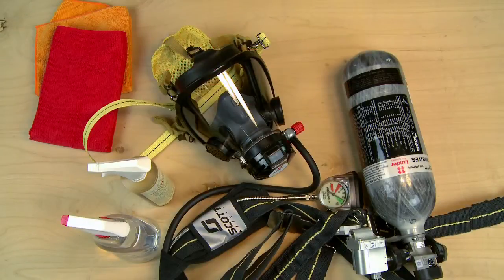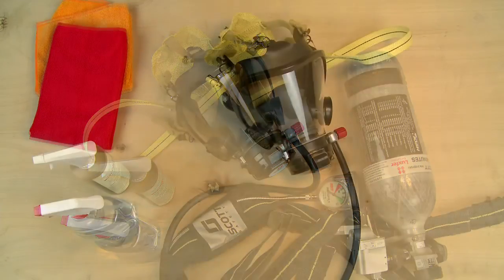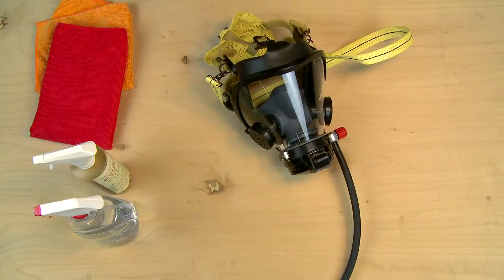After each use, the respirator should be thoroughly cleaned and disinfected, following the procedures as described in the operation and maintenance instructions originally supplied with the respirator, or by the procedures contained in your organized respiratory protection program. We will briefly run through some of these cleaning procedures here.